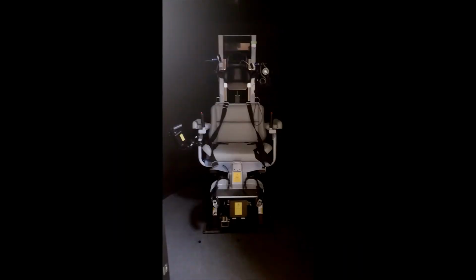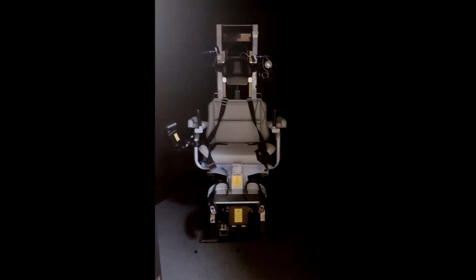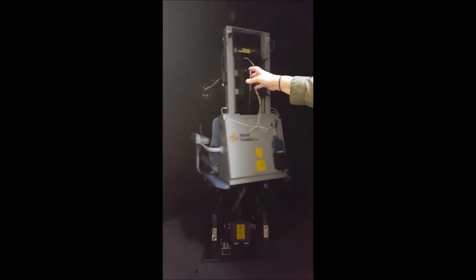Now that we know what the chair is testing, let's look at what will happen during the appointment. First, let's look at the chair. The motorized chair turns to both the left and the right. I know at a first glance it looks pretty intimidating, but don't let looks deceive you. The chair will be moving, either in a complete circle or side to side, but not nearly as fast as, say, like when you cross the street and you turn your head both ways to make sure no cars are coming. You'll be seated in a chair.